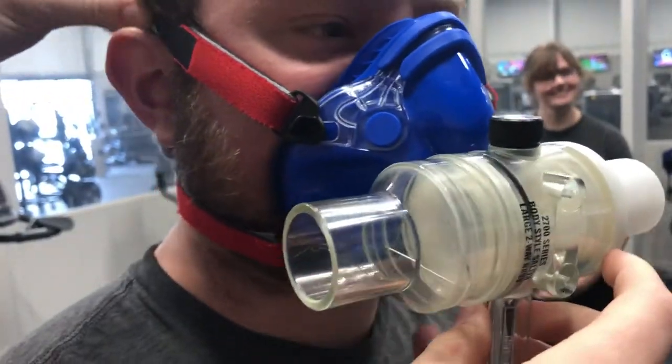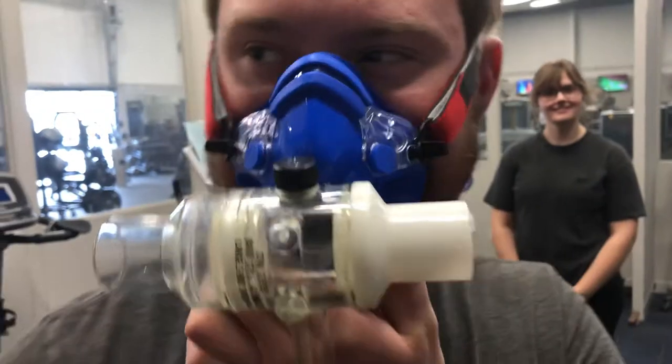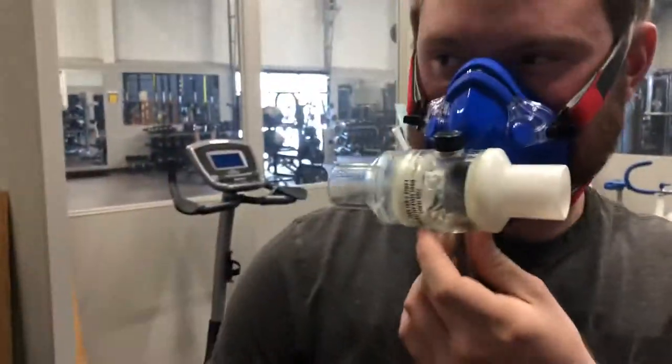Is that comfortable? Yeah, how are you feeling? Good. Shake your head around a little bit to make sure it's not going to go anywhere. Yeah, that's fantastic.